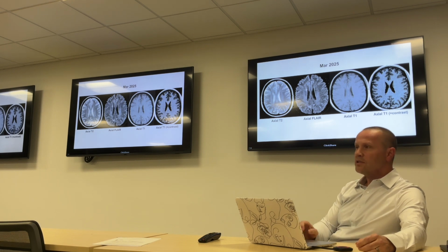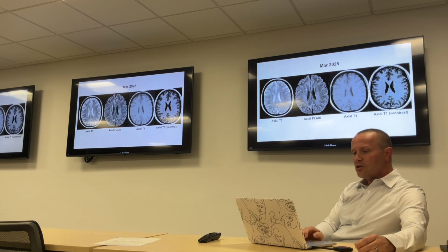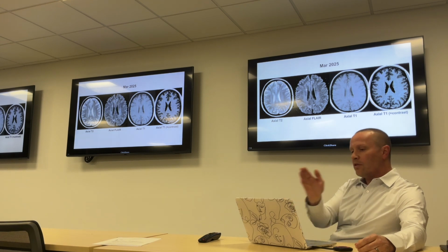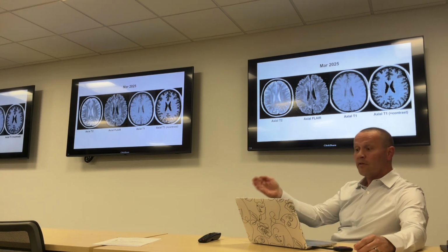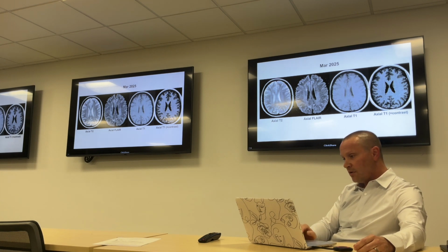The chronic ones are like this little lesion over here. If I had looked back over a couple of studies before that, it was no different. Every study looked exactly the same. It didn't show an enhancement, and you can see here, I don't know if we go exactly through it, but it doesn't enhance, right? It doesn't look like this one for sure.